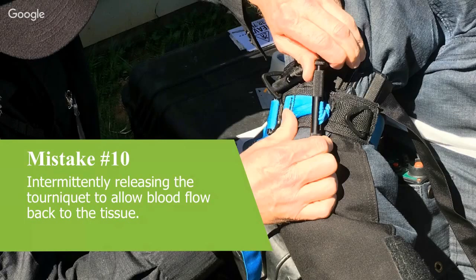Other factors to think about here, arterial tourniquets hurt. They hurt like buggery, and the casualty, if they're conscious, is going to be in a lot of pain. On occasion, if they don't understand, they're going to be begging you to take that thing off, or to release it a little bit, to give them some blood flow, relieve the pain, basically. So you want to resist that temptation that the casualty might be screaming at you.